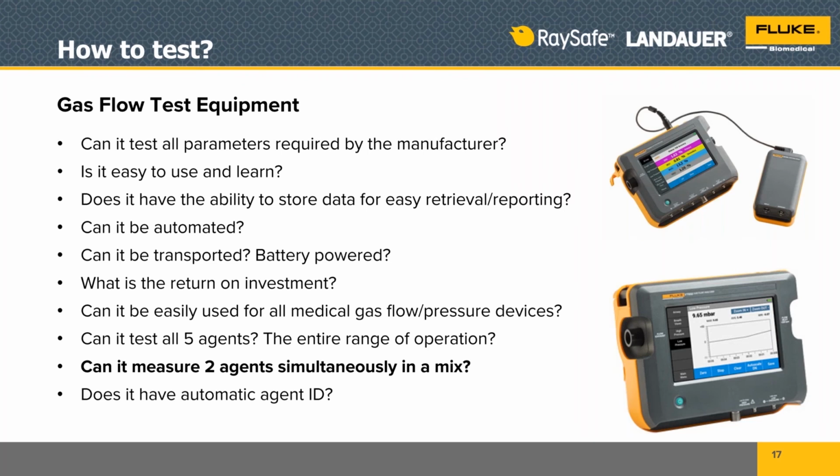Can it test all the agents? Can it measure two agents in a mix? And does it have automatic agent ID? These are some things that we recommend you think about when you're thinking about your gas flow test equipment.